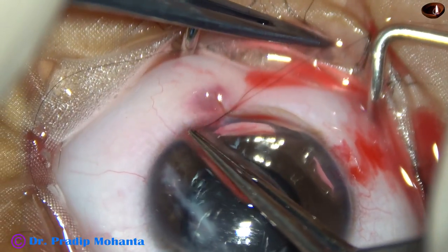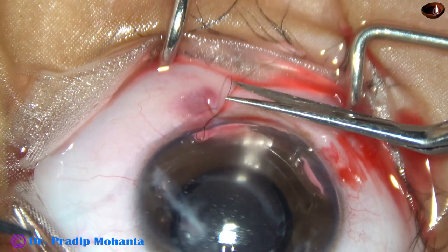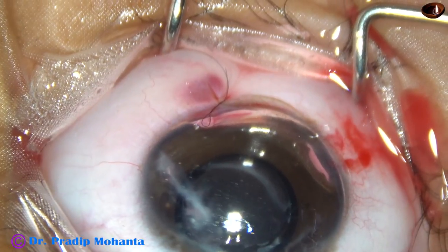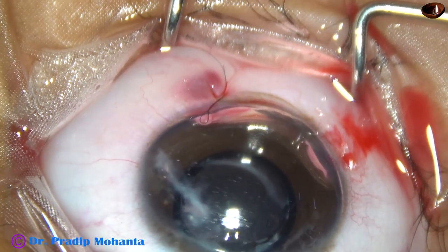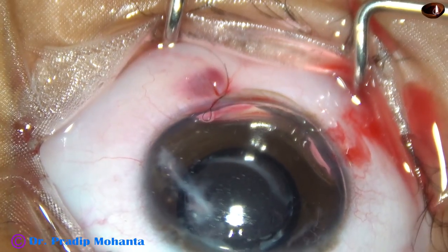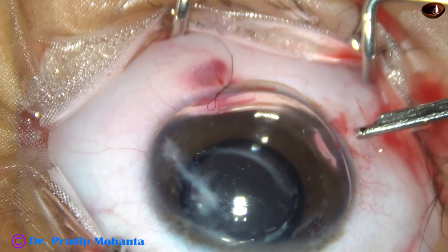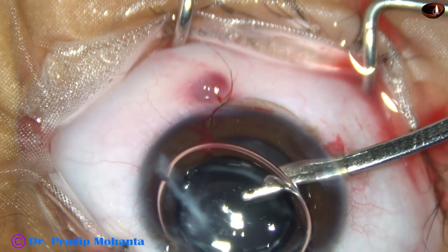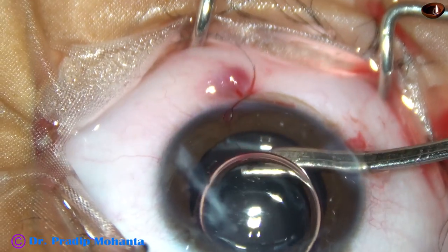Cut the long thread with the needle and keep the other thread longer like this. In children this is a very useful surgery — in the outpatient department with a loop we can just hold the longer thread and pull it out. But if it is a permanent buried knot, what happens is we have to put the child again under general anesthesia.